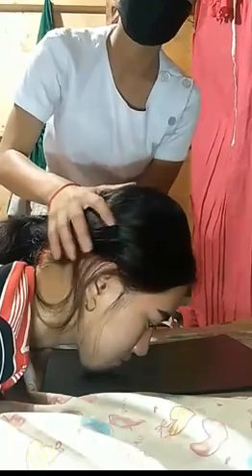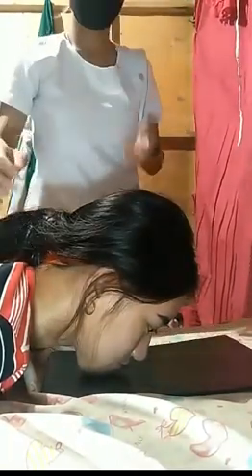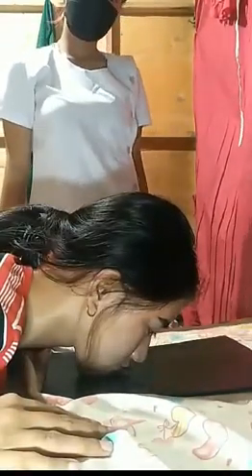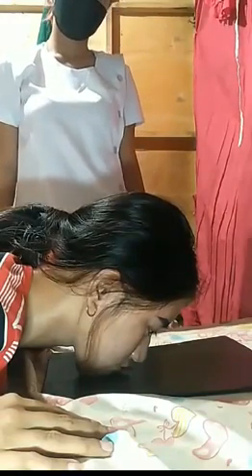Rest the patient's chin on the IR holder. Adjust the patient's head so that the mid-sagittal plane is perpendicular to the plane of the IR. Adjust the flexion of the patient's neck so that the OML forms an angle of 55 degrees with the plane of the IR. Respiration suspended. The central ray is perpendicular through the mid-orbits. Instruct the patient to close the eyes and concentrate on holding them still for the exposure.